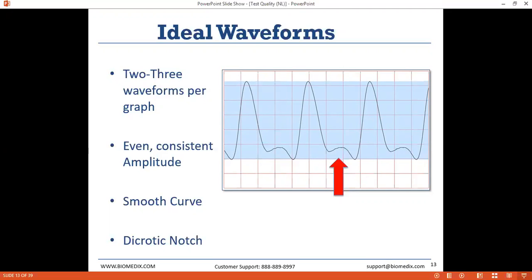I've seen patients where you can only fit 2 waveforms on a screen. I've even seen patients where it's only possible to fit 1.5 or so. In that circumstance, you just try to get as many waveforms as you can, and you want your waveform to be a model, or an ambassador, so to speak, for the other waveforms that we're not able to fit on the screen.